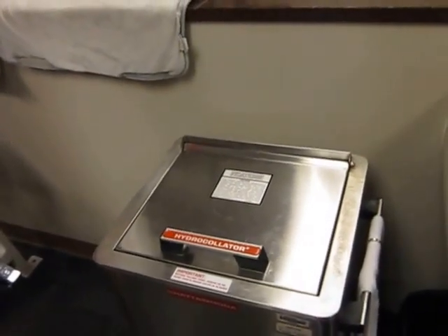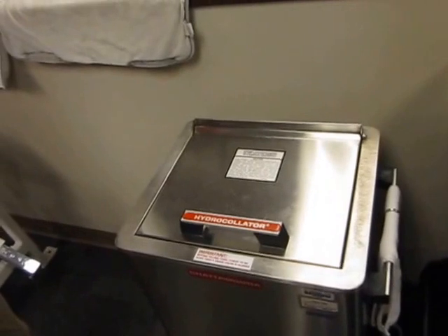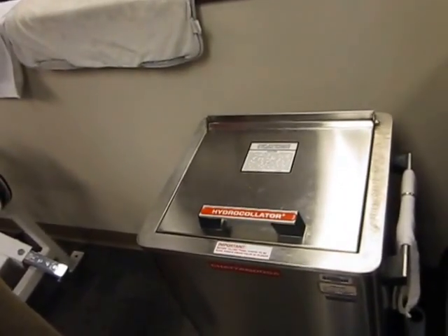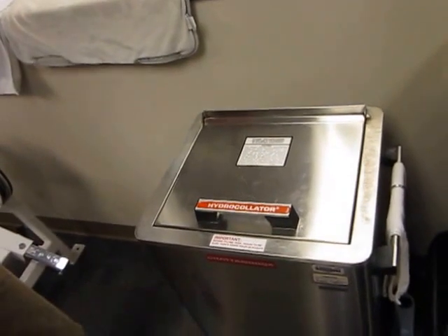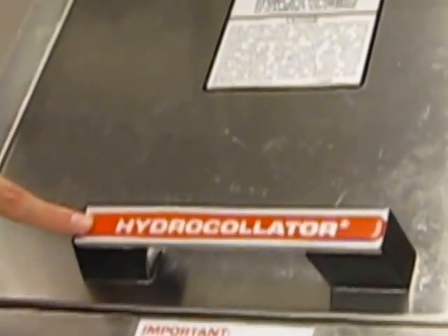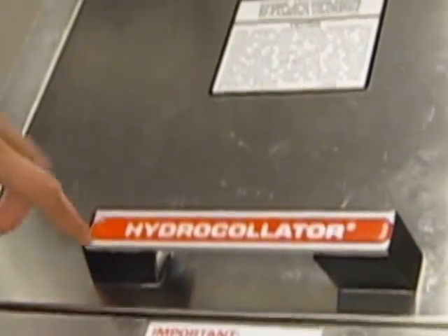We wanted to show you the type of heating pads we use here at Iowa State University Physical Therapy and Sports Medicine. The unit you see here holds our heating pads. Other names you may hear for these specific heating pads are hydroculator, which you see right here, or moist hot packs.